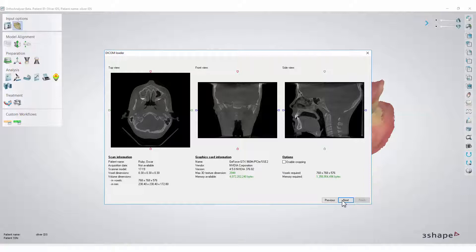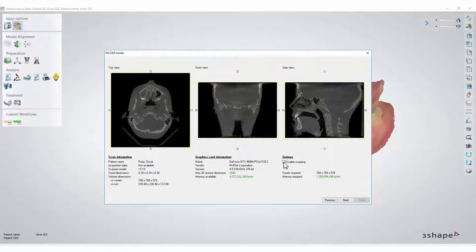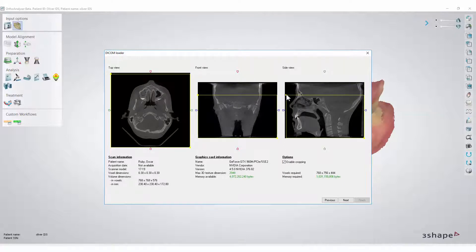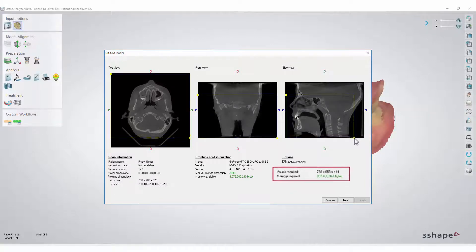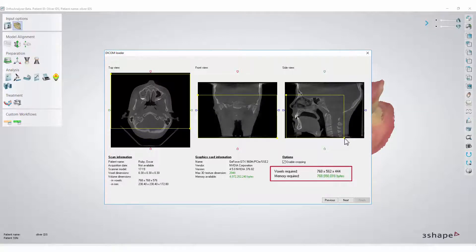To do the cropping, select Enable cropping. A yellow outline will appear. You can pull the yellow dot and crop the picture to a different size. You will see the required numbers decreasing.